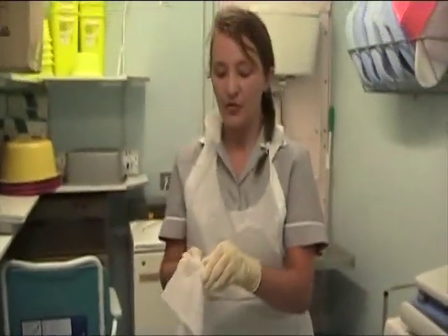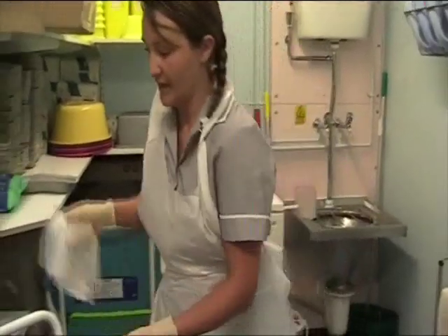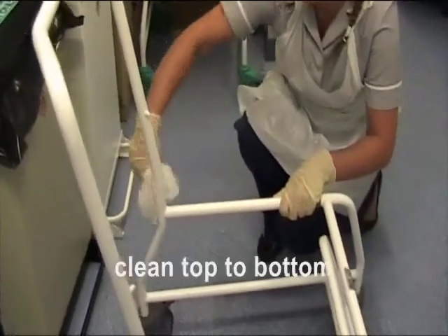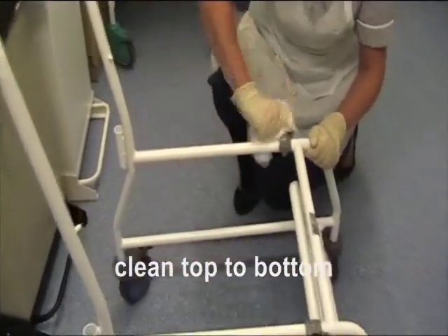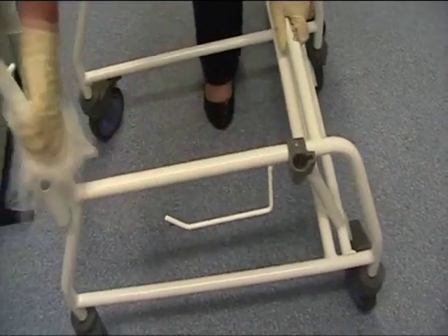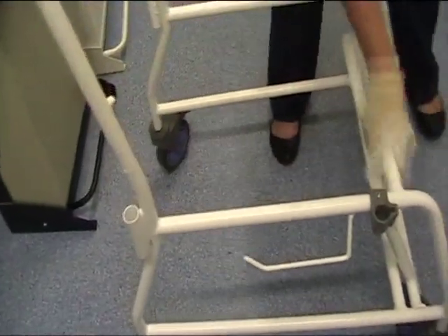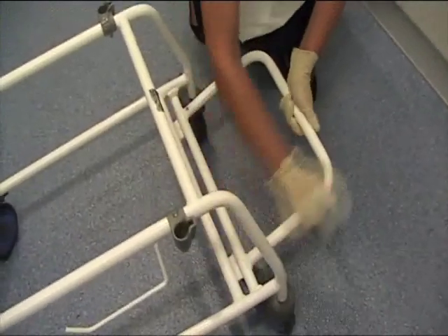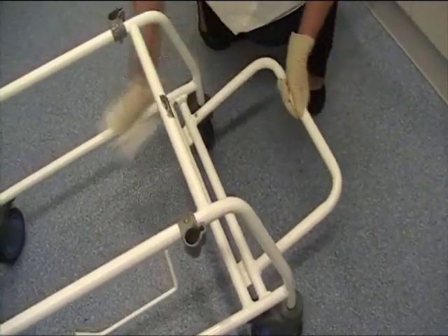Now all the parts have been removed, you can access and thoroughly clean the frame, ensuring that you get the end underneath of the frame also.